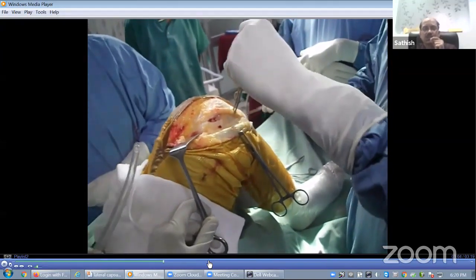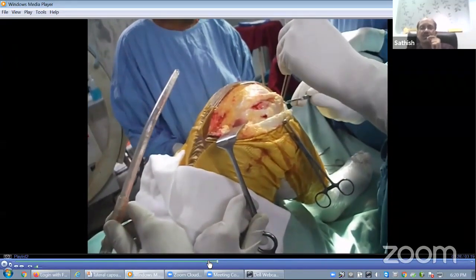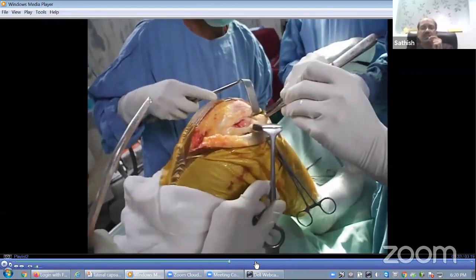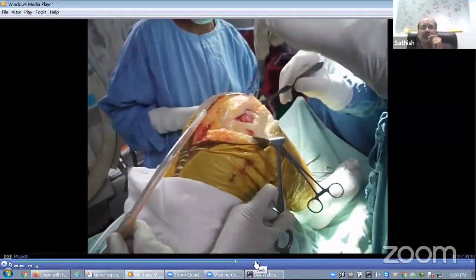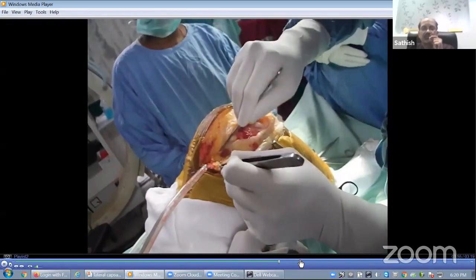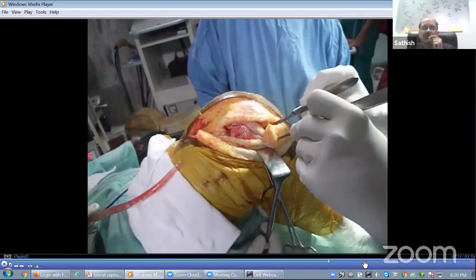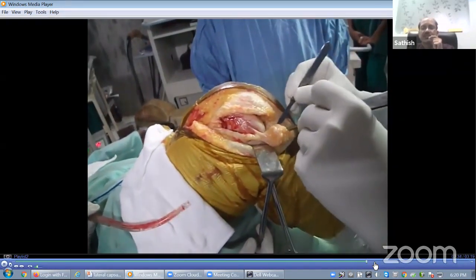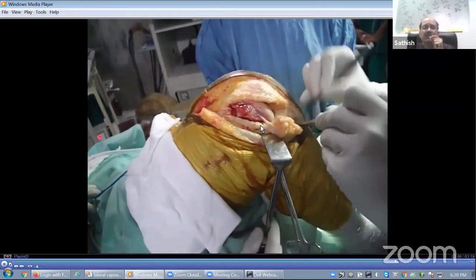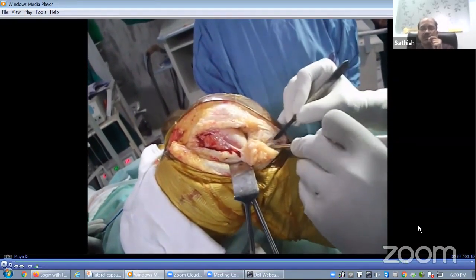So you continue the dissection downwards. When you continue the dissection downwards, we take all the retropatellar fat which is behind the patellar ligament. You take it along with that sleeve and take portions of meniscus also. Cut the lateral meniscus anterior aspect, and take one portion of that also. So everything has to be retained. And in continuity downwards, we release the iliotibial band. So you can see here the fat pad and the meniscus, everything is there, and we are releasing the iliotibial band.